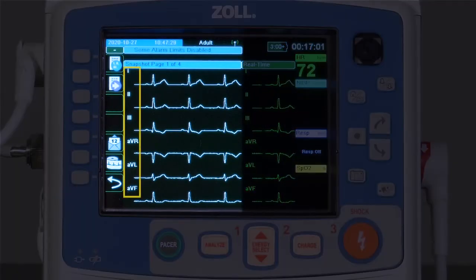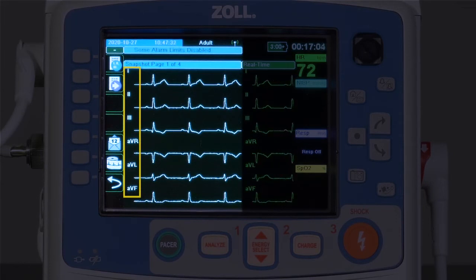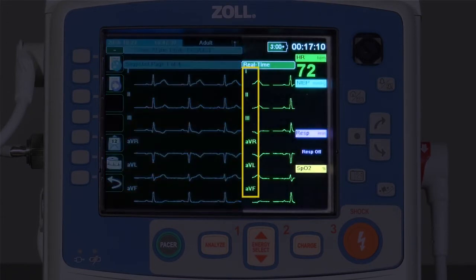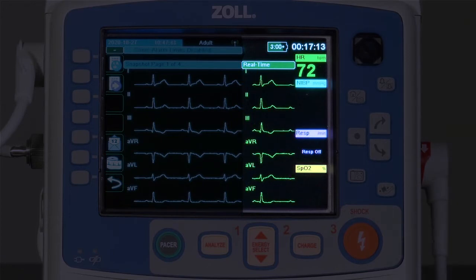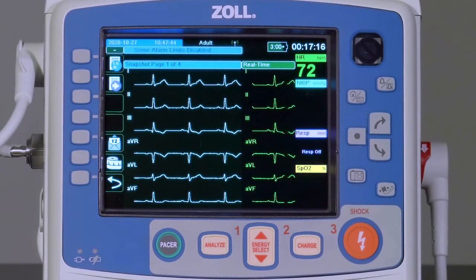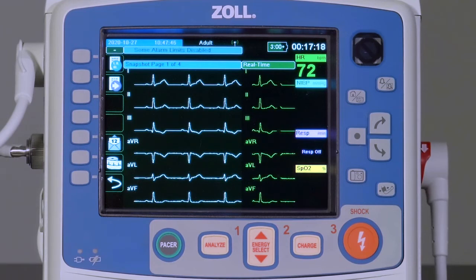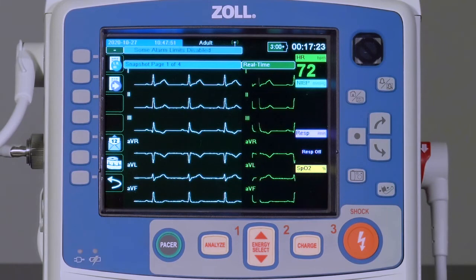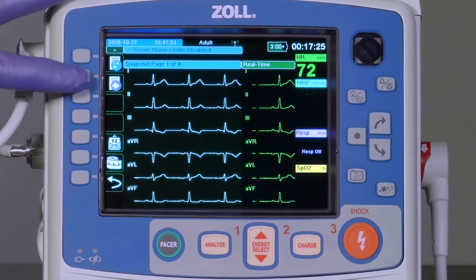Note that leads 1, 2, 3, AVR, AVL, and AVF from their acquisition are shown on the left, and the corresponding live view of the same leads is shown on the right. The X-Series Advanced records a full 10 seconds of each lead and divides it into four separate 12-lead snapshot pages. Each page represents 2.5 seconds from the acquisition.